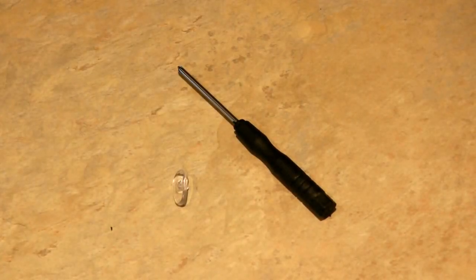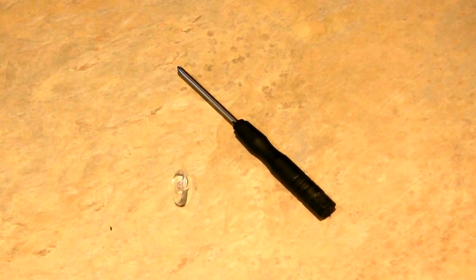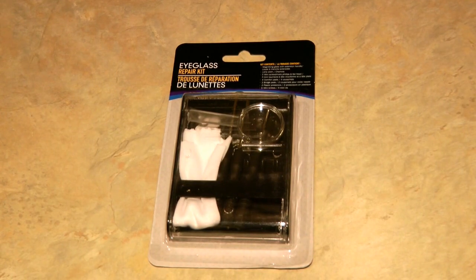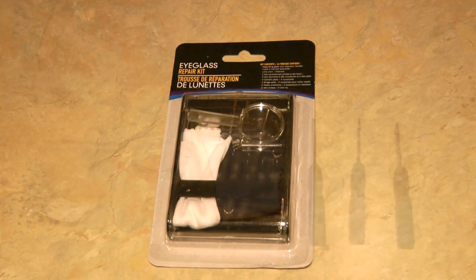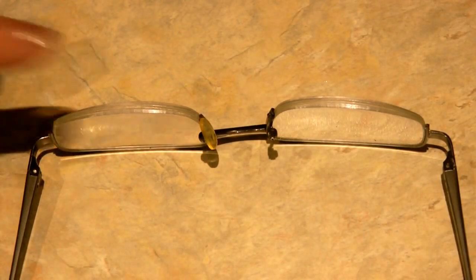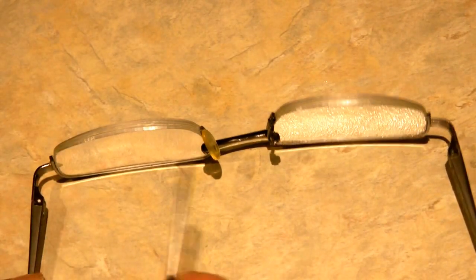All you need is a little screwdriver and a silicone nose pad. I bought mine in a kit for one dollar at the Dollar Tree, which included the screwdrivers and the nose pads. If you look at the edge of the nose pad where it's attached to the glasses, there's a little tiny screw.